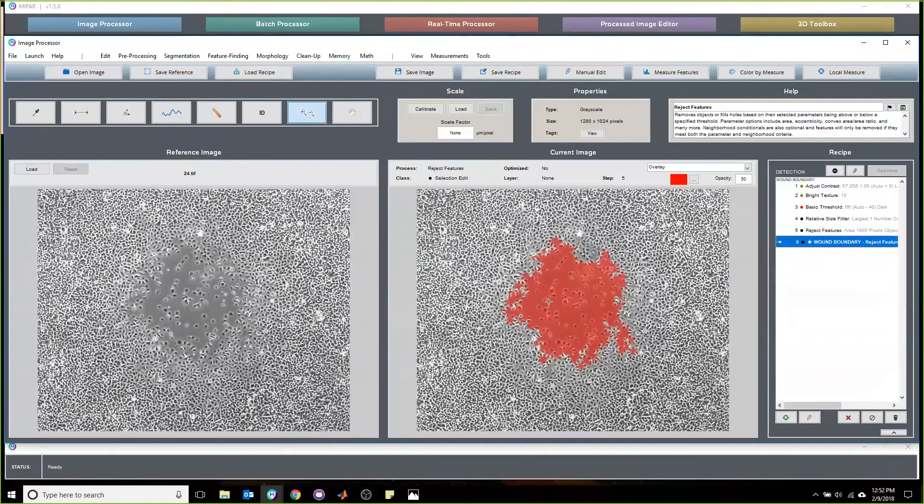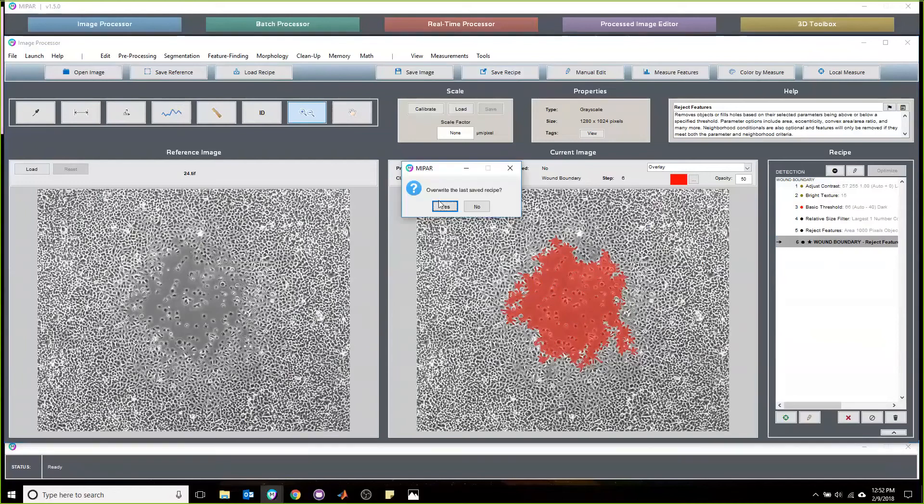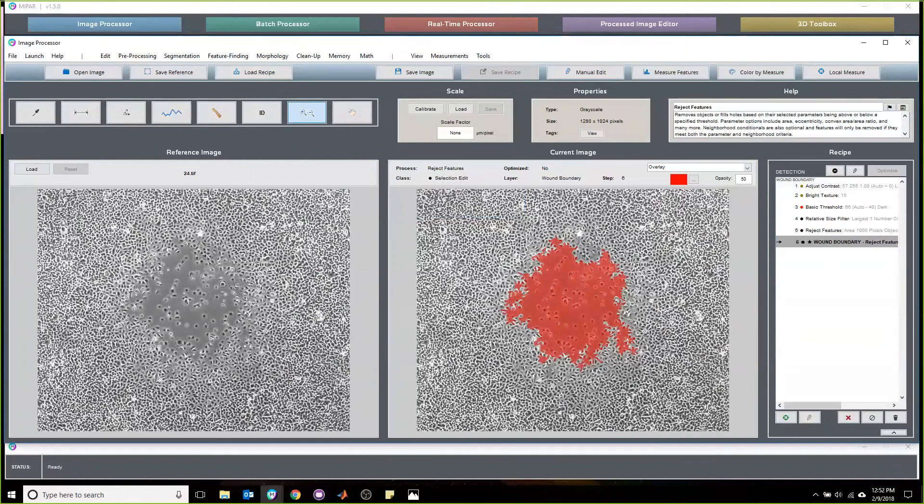The last thing we do is just fill in these holes to give us the wound itself. So this is entirely—let me just save this really quick. Let's demonstrate this.